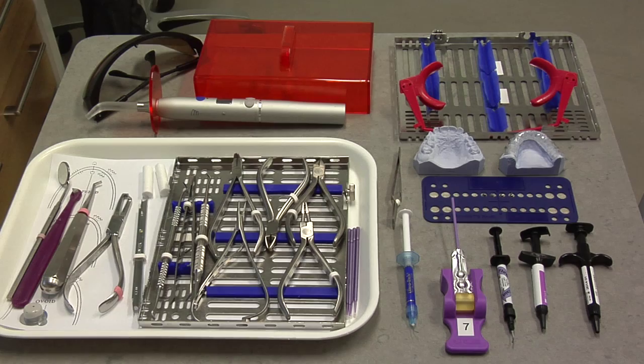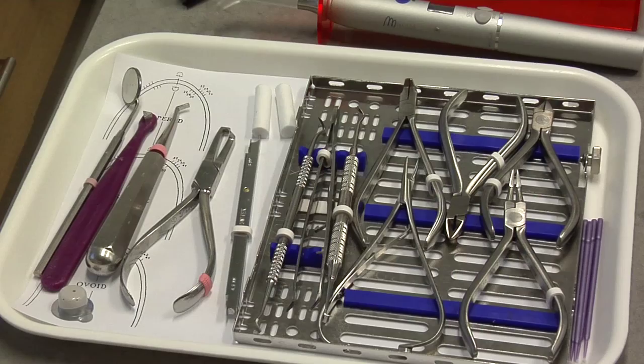This here is the basic setup for a patient who will be receiving brackets. These are all the instruments that we use in the mouth. These here are the materials that we use in the mouth.